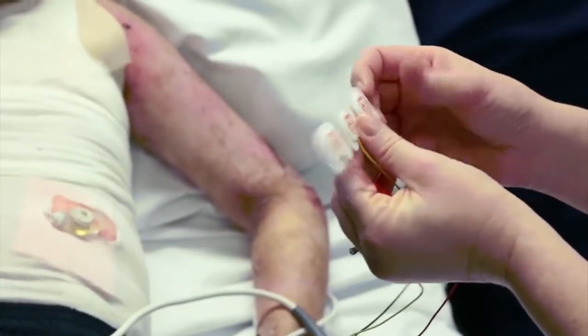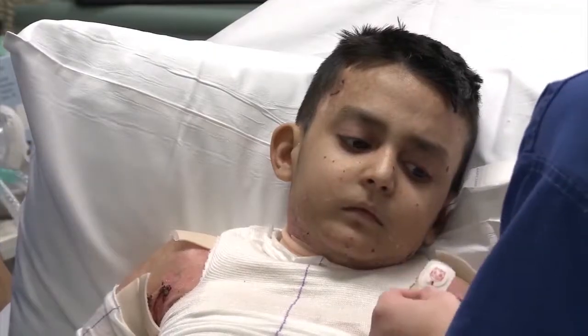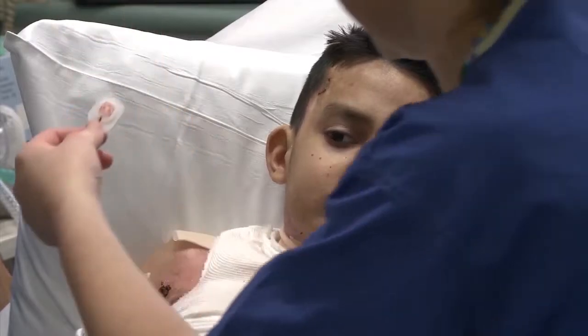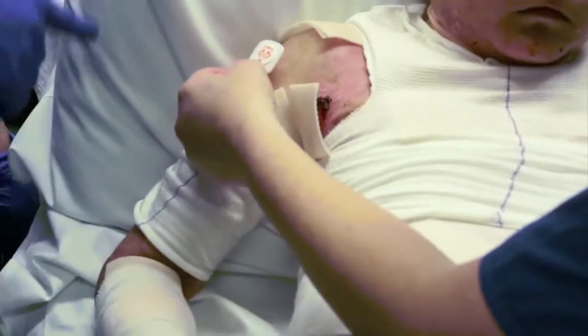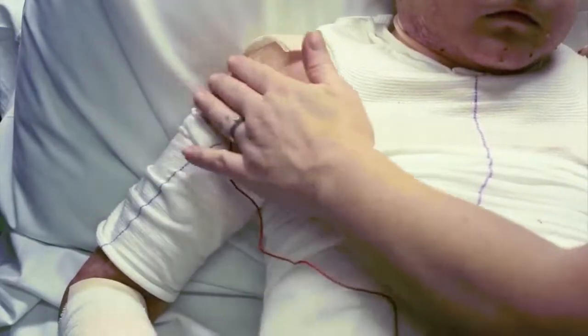For some children, ECG electrodes can be placed directly onto the skin and removed using an anti-adhesive spray such as Niltac. Other children may require 3M defibrillation jellies to be first placed onto the skin to conduct through to the electrode.